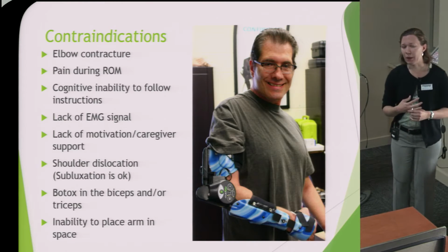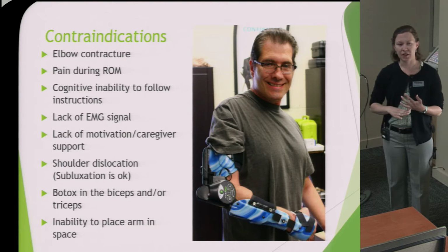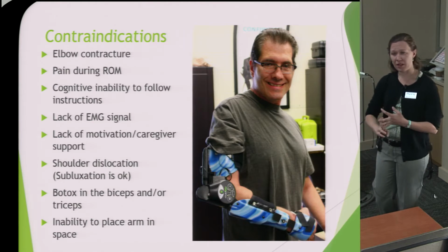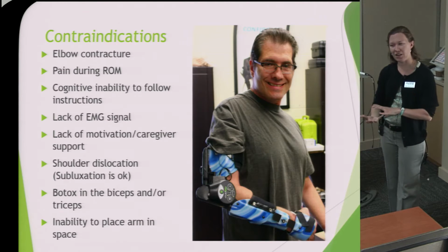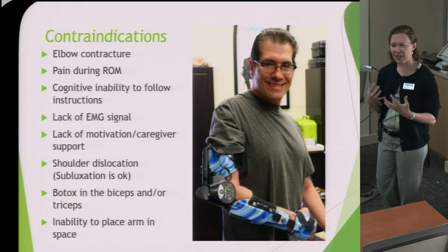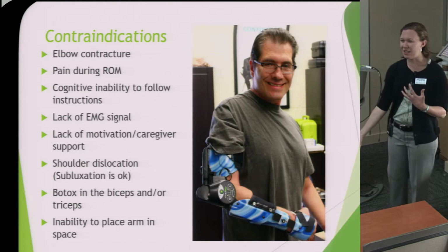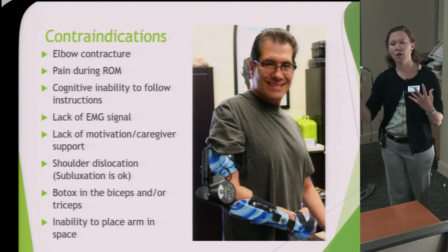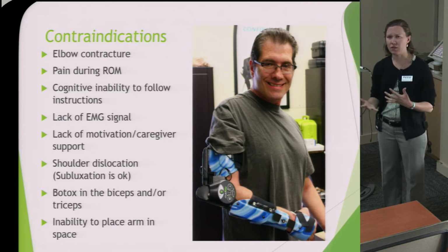That being said, this is pretty rare. We don't see this a whole lot, but where we do see it is right after the onset of a condition. So right after a stroke, right after a spinal cord injury, something of that nature. But if you give them 2 or 3 months and then reevaluate, a lot of the time we do have enough signal that we're able to work with it. I kind of use the example of your classic stroke patient who right after the stroke is really flail. You see them a few months later and they've got just tone in their arms here and you almost can't get it to extend. So same idea there. It's always worth rechecking somebody if you do run across that.